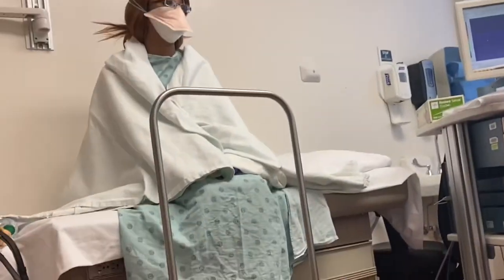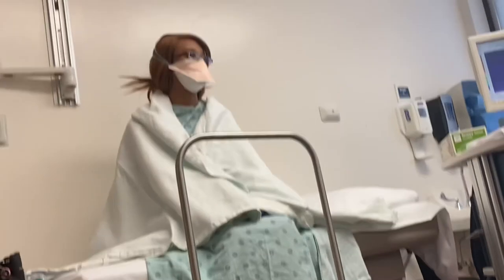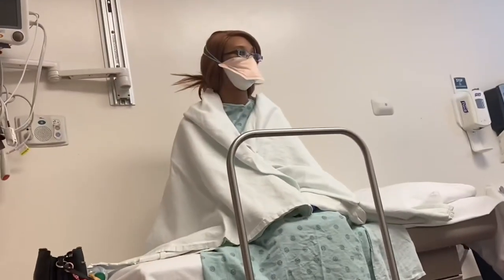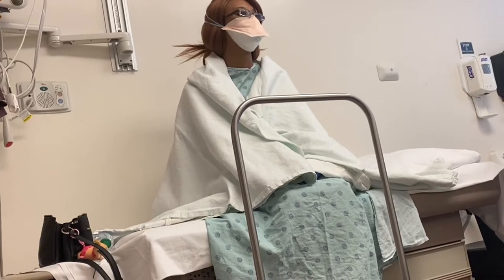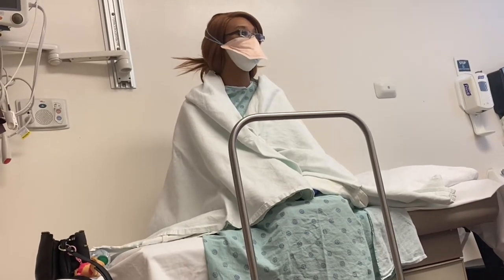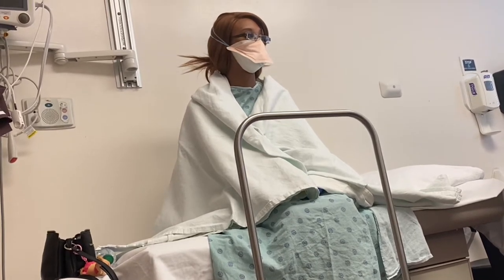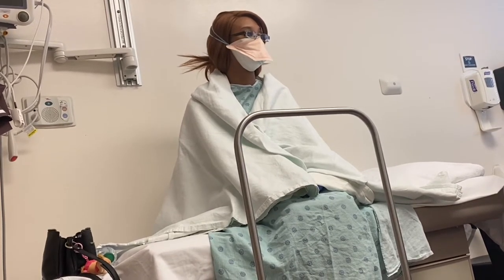And then once I get the tube down, I'm gonna ask you to lay down on your left side. And I'll ask you to please swallow some water while you're lying down, and then swallow some water while you're sitting up. It'll take us maybe 30-45 minutes. Take that out, you have a little break, because I have to get a report. That report tells me where I'm gonna put the overnight. You're aware of the overnight tube?